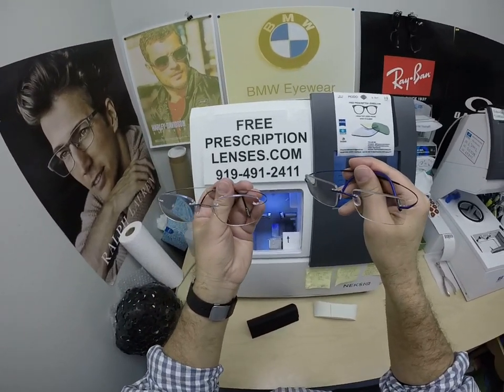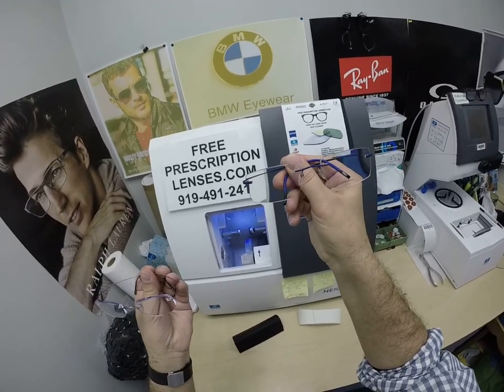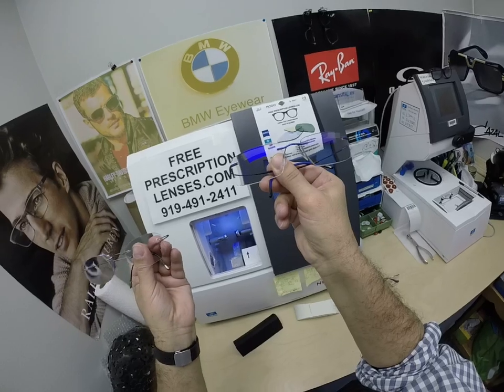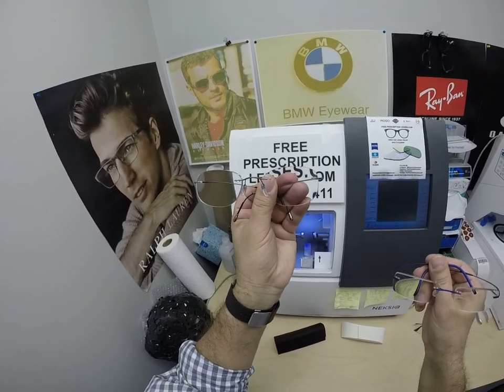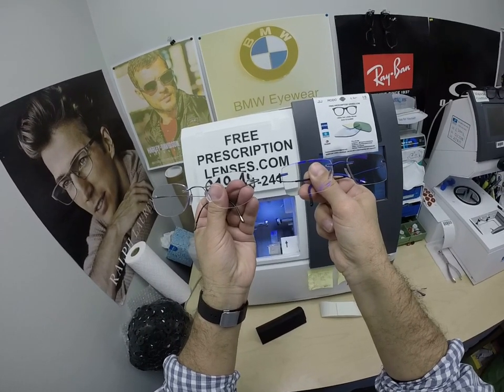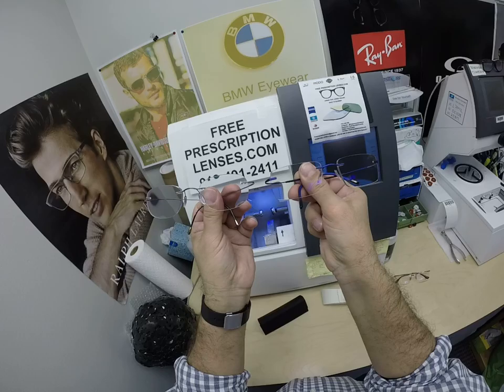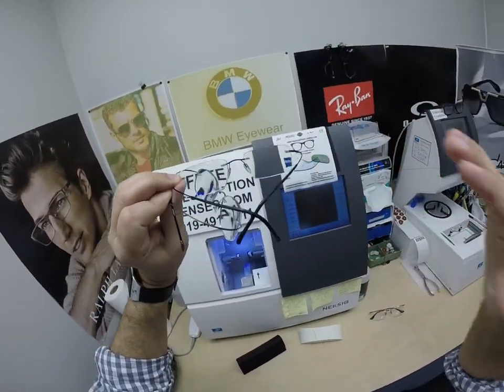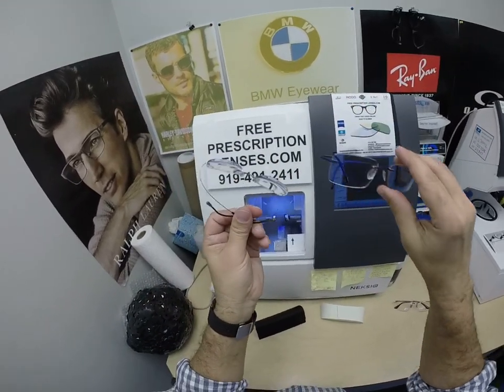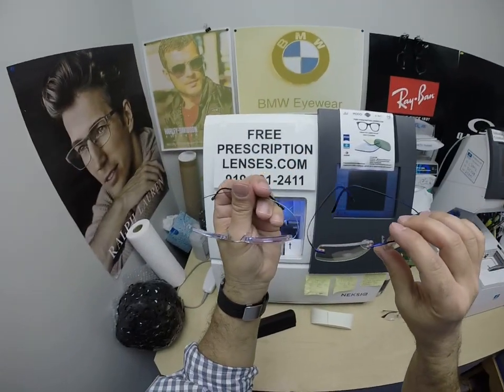The reason why I did not polish the edge of my lenses is that it can actually let glare in through the lens. We both have anti-glare treatment on both lenses — I have Crizal Provencia on this one, and Jay got the Zeiss DriveSafe Chrome. Anti-glare reduces glare when driving at night, particularly in the rain, but also from street lights, stop lights, computer screens, and fluorescent or overhead lights. The purpose of anti-glare is not to allow glare into the lens — they're both front and back surface coatings. So if a light source is behind you, it reflects off the lens back into your eye. When the edge is polished, fluorescent lights or any light source can now come in through the top or edges.